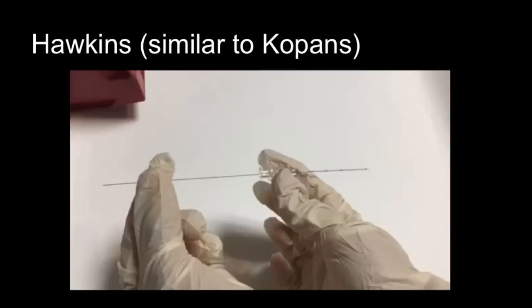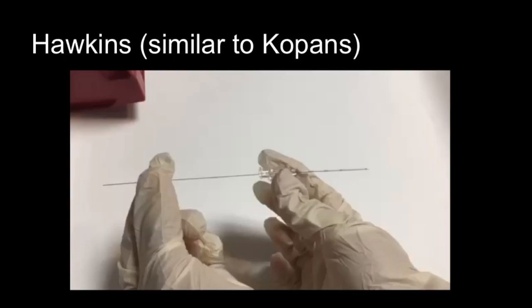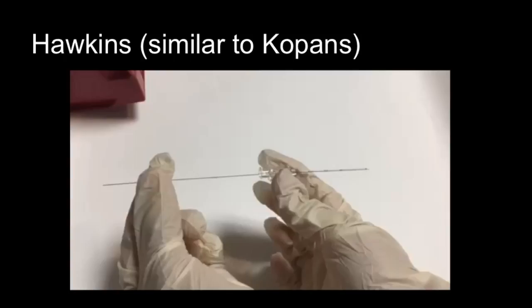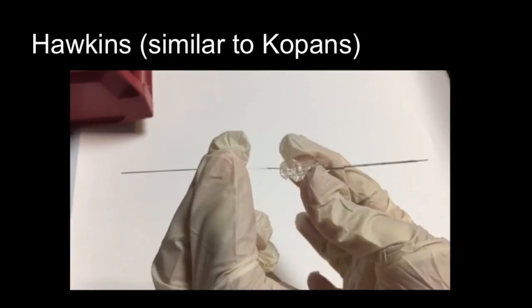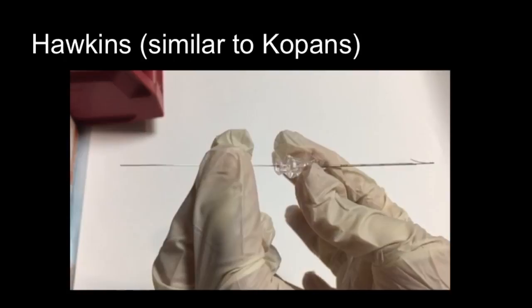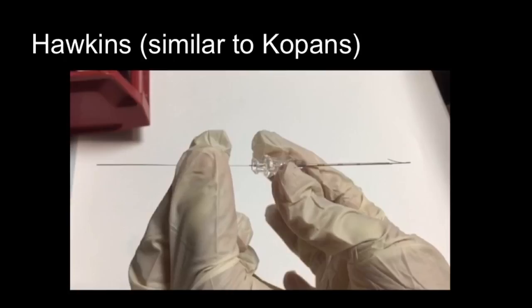The following demonstrates the Hawkins needle wire apparatus, similar to the Copen's and Giatus needles. For non-repositionable wires, the wire is completely removed from the needle prior to insertion. Once the needle is appropriately positioned with the tip at least one centimeter past the target, place the wire into the needle and advance slowly until the first black mark reaches the hub, confirming the wire tip is at the needle tip. Then advance to the second black mark to confirm deployment. Firmly hold the wire while slowly retracting the needle out of the breast until fully removed.